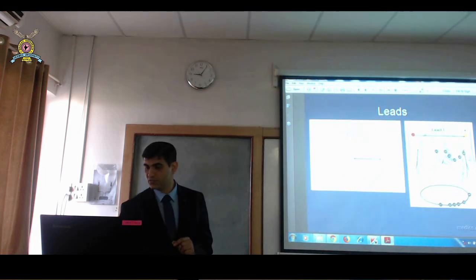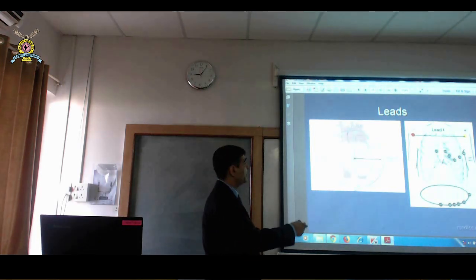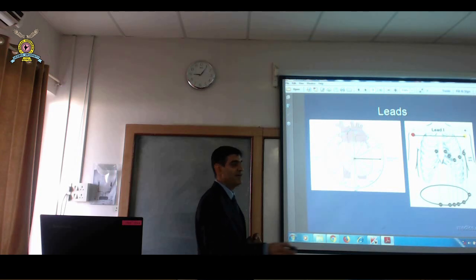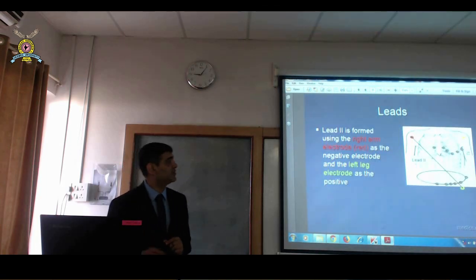Now coming to the next one. So I showed you this picture. This is the main picture. Every time you will see this picture. I showed you this, right? If the ECG signal is traveling here, it is positive in lead 1. That's what you told me. Right? So very simple. Now the next one is lead 2.